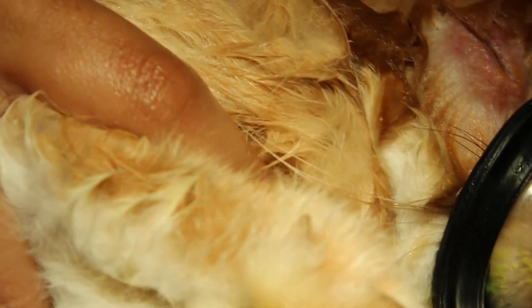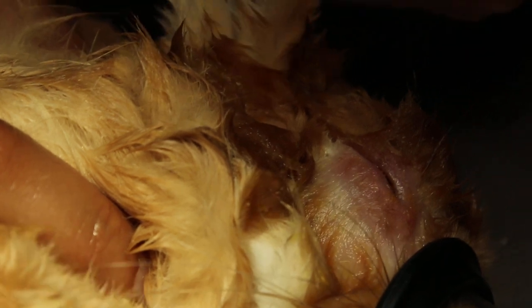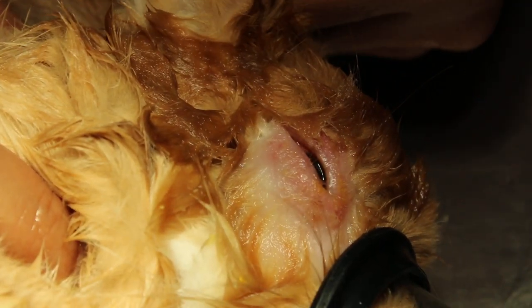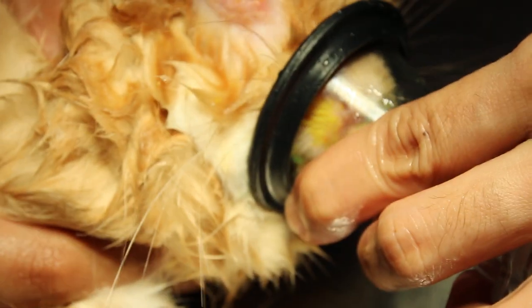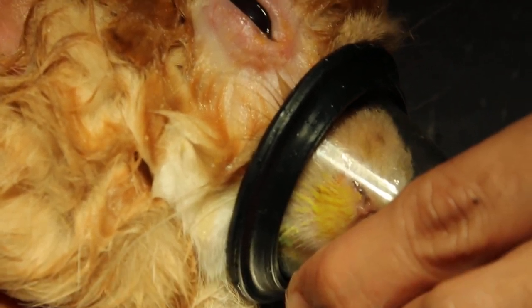The rabbit is very unhappy. Put some gas. Yeah, there's the water — okay, just one time. This one is one or two times. See, it didn't come out. There's some gas still. I put the five again for a few seconds. So we just do one irrigation. I normally count up to ten.